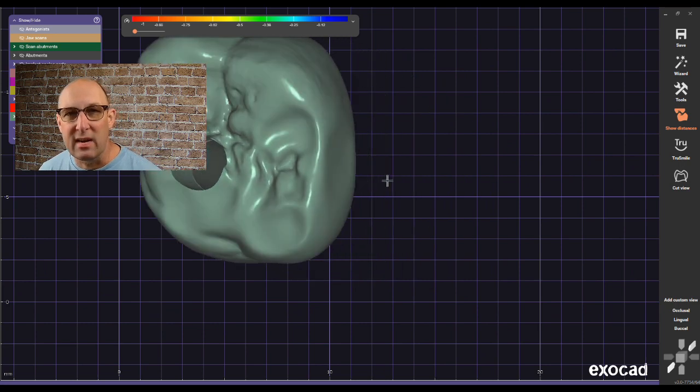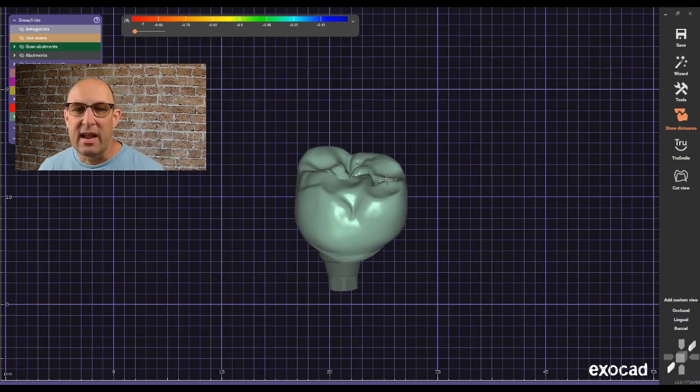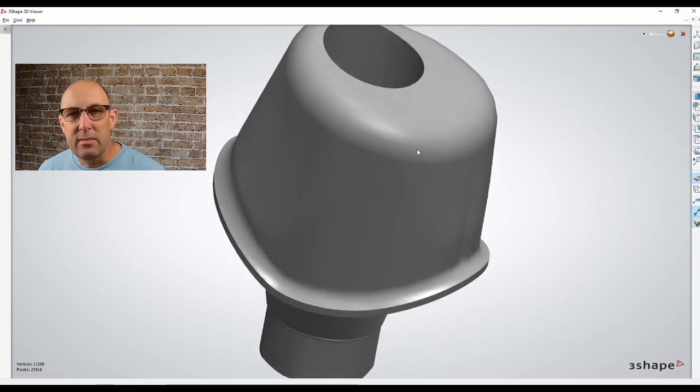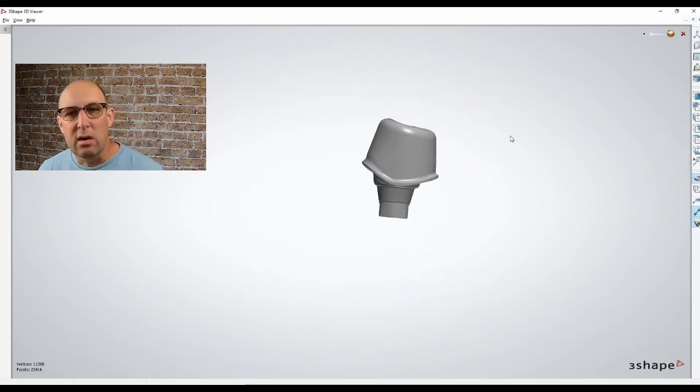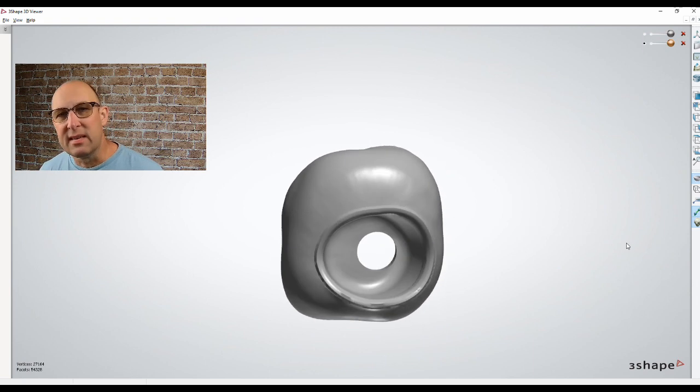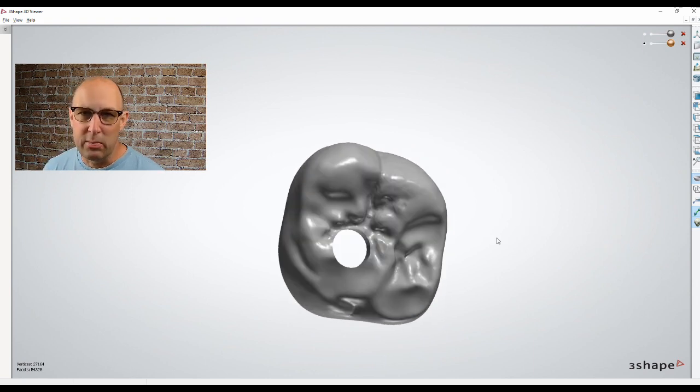You can see everything is perfectly aligned. When you're finished, your abutment and crown are perfectly aligned with a nice hole — and you've created a screw-mentable crown.